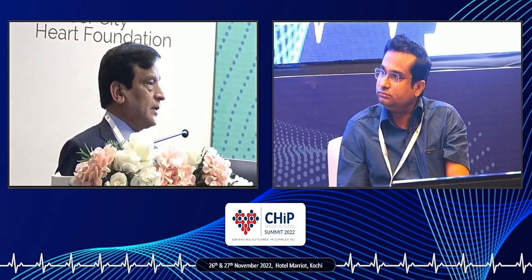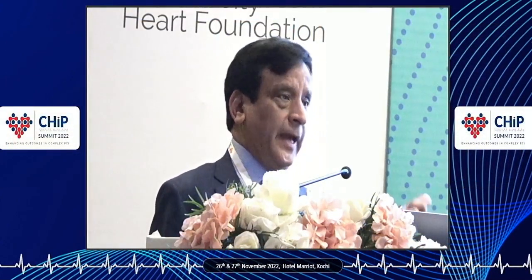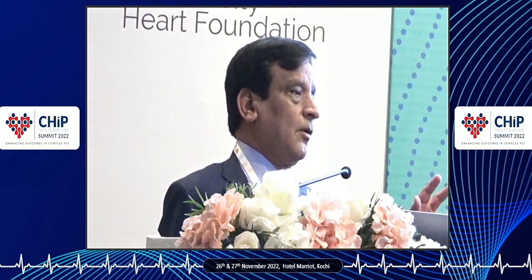So I would not say that there is any factor, whether long lesion, they're all severely calcified anyway. Maybe there was something intrinsic to that patient which gave rise to asystole, where you need a temporary pacemaker. A rare case could happen. I don't recall that any non-ostial LAD or left main developed asystole during rotational atherectomy, but it could happen. There is no predictor for that. But clearly predictors are the right coronary, dominant right coronary with a long lesion, and left circumflex with a long lesion, sometimes ostial LAD and left main.